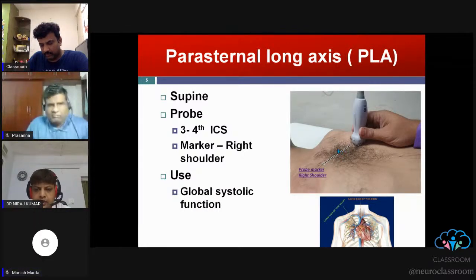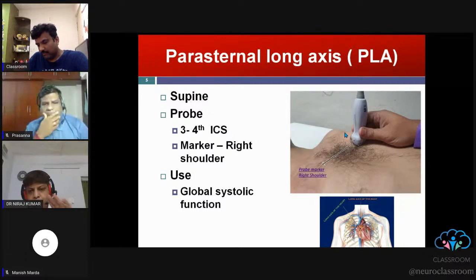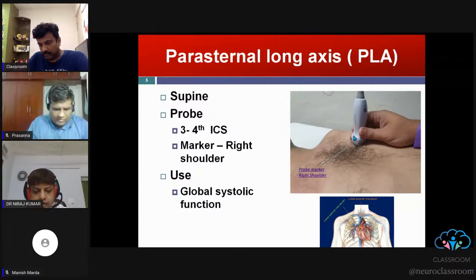Remember, the majority of the people are using this orientation marker here. But in some textbooks or in some articles, you will find this orientation marker in a different direction, or just opposite. So here, one thing I want to clarify: if you are using your screen marker on the upper right side, then in this presentation we are making this assumption, and according to that we have to keep the orientation marker.